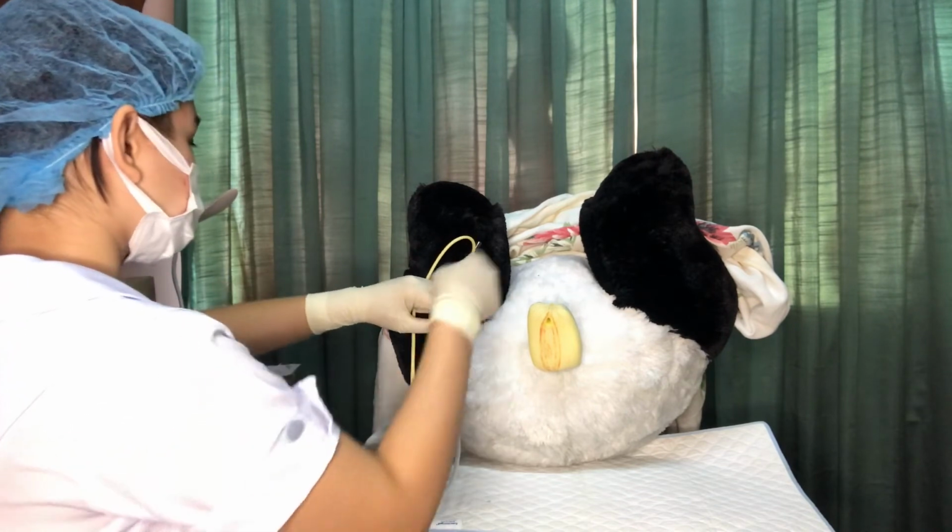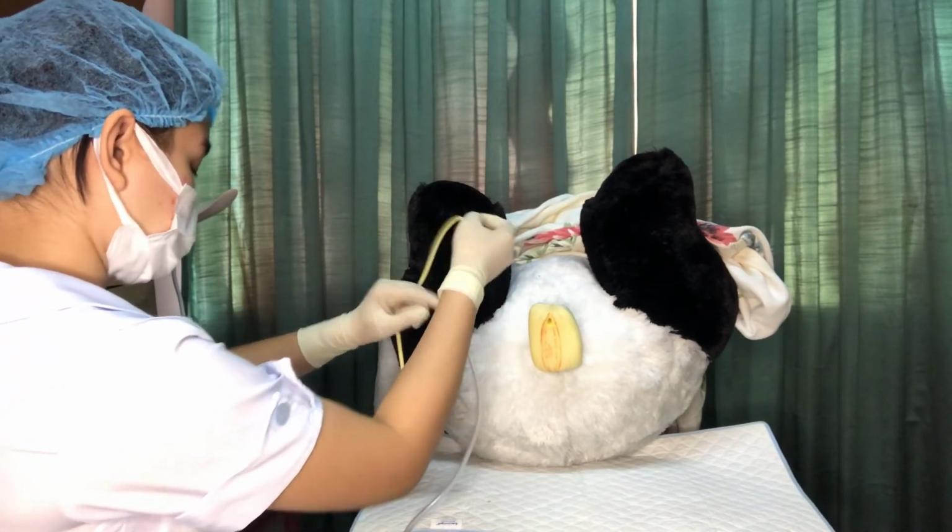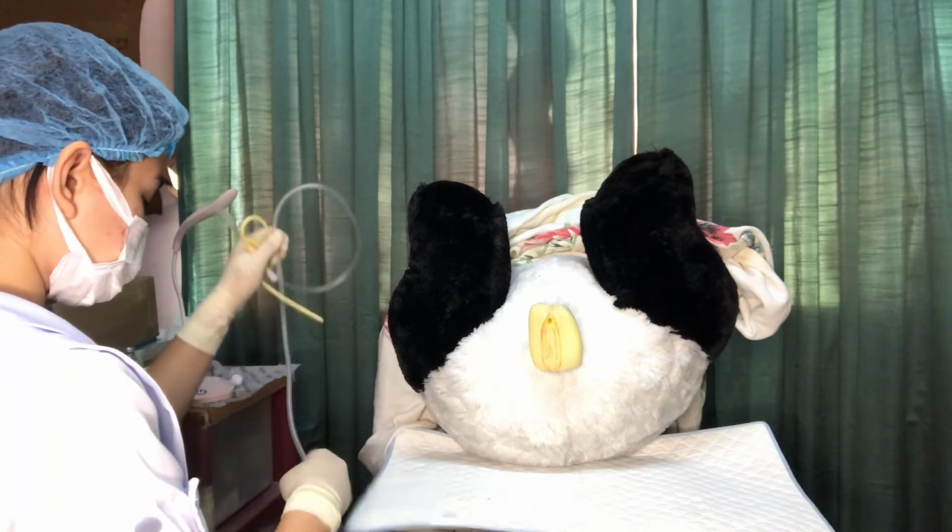So that's it. We already removed the Foley catheter. After the procedure, we're going to put away all the used materials and place them in a waste receptacle. So this one is an aseptic method, and all the used materials after the procedure are non-aseptic. And then we're going to help the client into a comfortable position. After that, we're going to remove all the PPEs that we've worn. The rationale behind this is to prevent any infection or bacteria from passing from client to nurse and nurse to client.